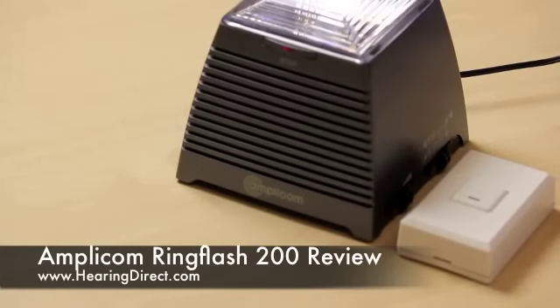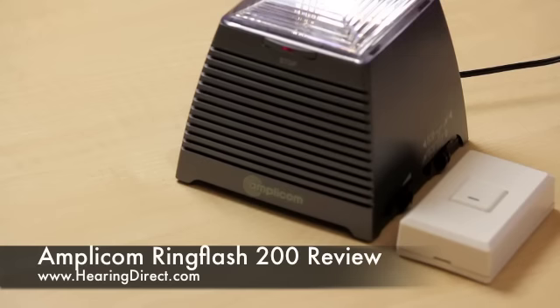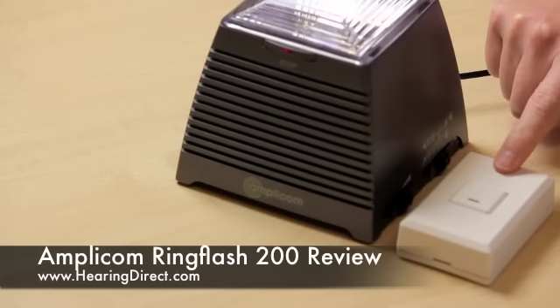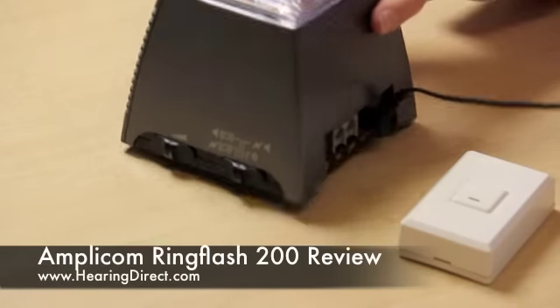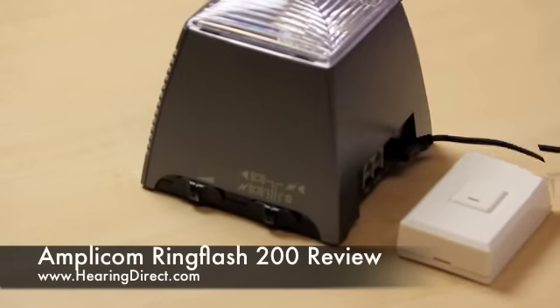The Amplicon RingFlash 200 is an alerting device designed to give the hard of hearing better awareness of when their telephone is ringing or when they have visitors at the door. The RingFlash is supplied with one wireless doorbell, and a phone can be plugged into the back along with the power cable. It is supplied with the cables that you need for the phone.